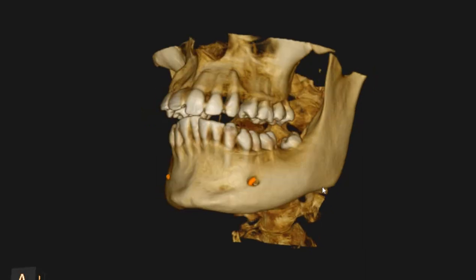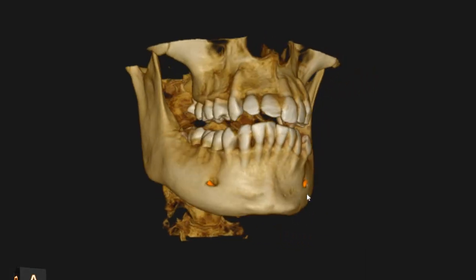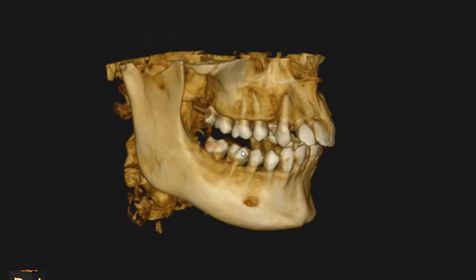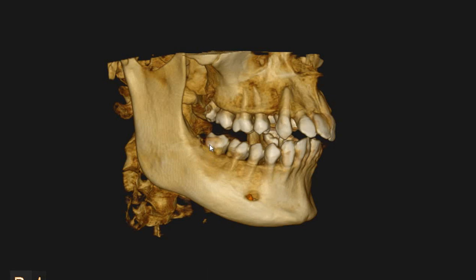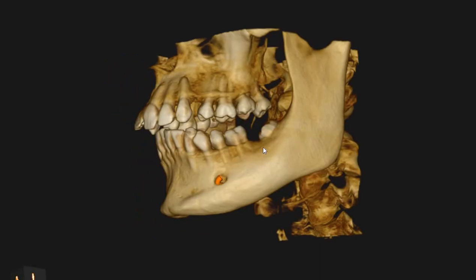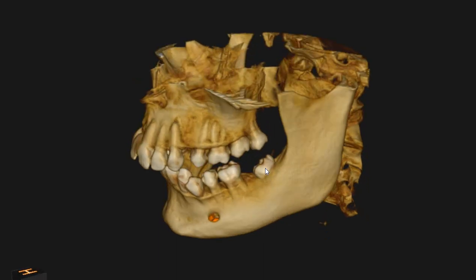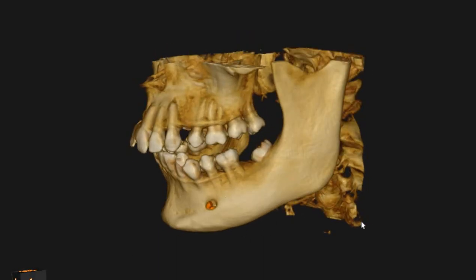Hello and Asalaamu alaikum, Ultrascan Diagnostics here. This is the CBCT of the patient that you had requested. The area of interest is 47, 48 and 37, 38, but we don't have a 37 — we only have a 38.